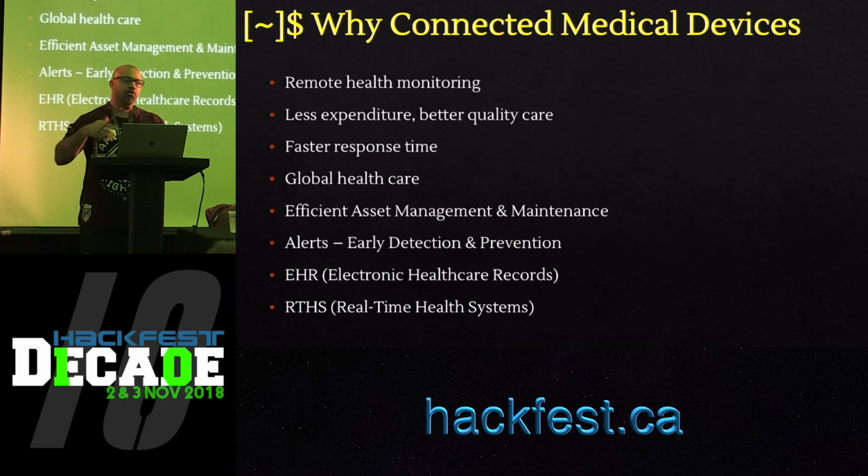And then the future of connected medical devices is going to be EHR and RTHS. EHR are electronic health record systems where all this data is aggregated and then saved for future analysis. But EHR were never meant to interact with medical devices in real time, so they're limited in their capability as to what they can do. But RTHS, which is real-time health systems, are more able to take that kind of action and interact with different devices.